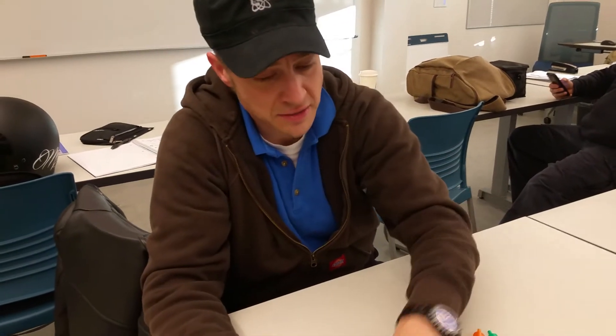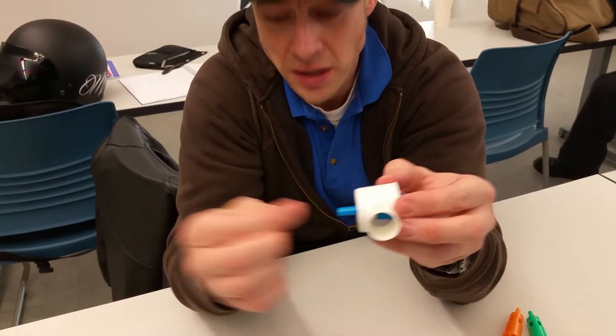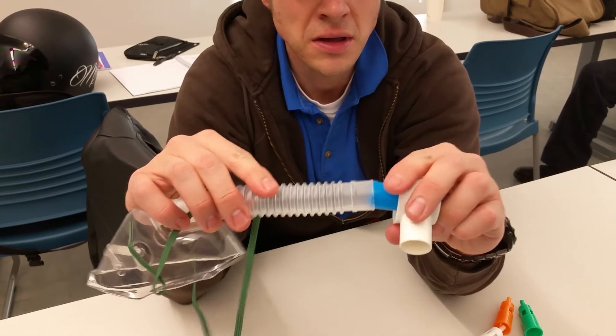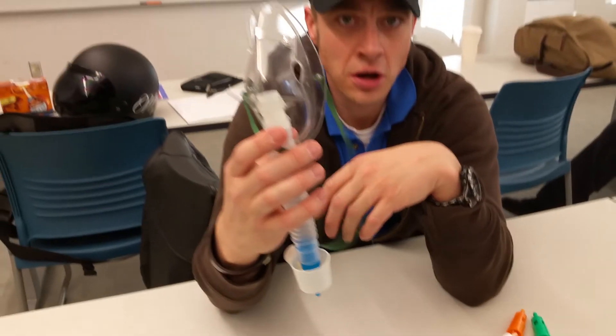You're going to connect it and push it in here like this, then connect your O2 tubing to here, connect it like this, and then put the mask on your patient.